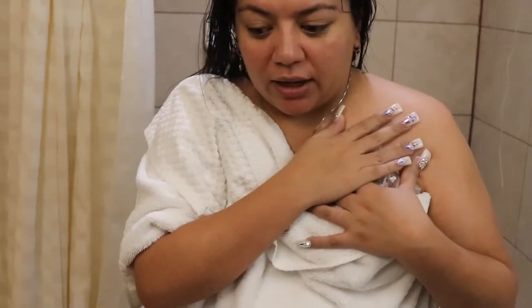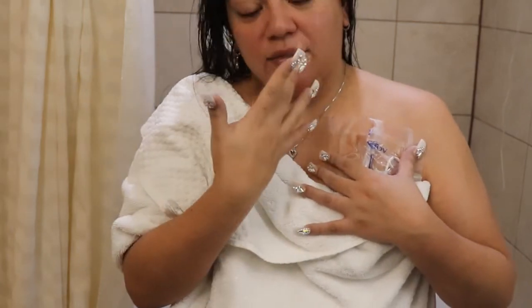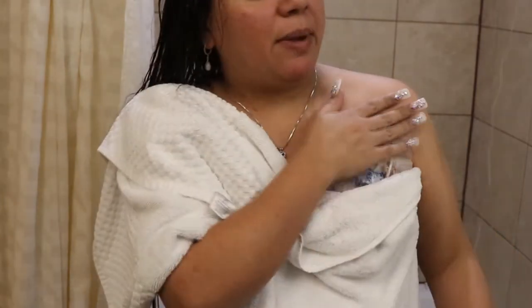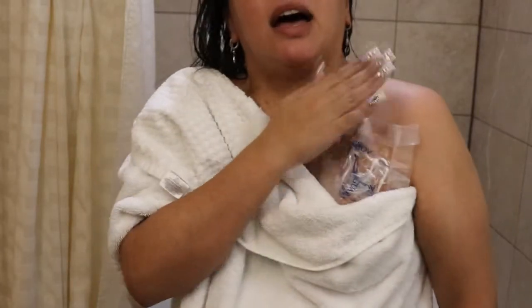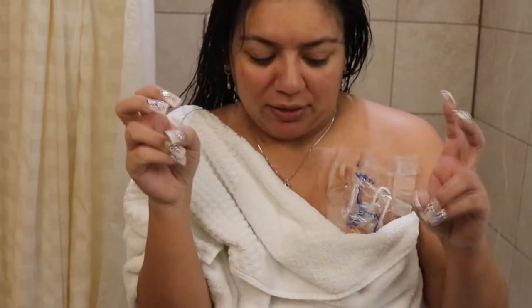But basically, as the shower is falling, this is always on the outside of the shower. So I'm never fully just standing under the shower of water. The water's always falling from my face, my head, to the center of my chest. And when I turn to my back, I put my hand over and I let the shower hit me right here and down. I don't ever fully immerse this in the shower. And that's something that I didn't even notice that I did until now that I'm trying to do a shower video. You can't put this on and think that it's just not going to get wet. If you're fully immersing yourself in a shower, it's not going to happen.